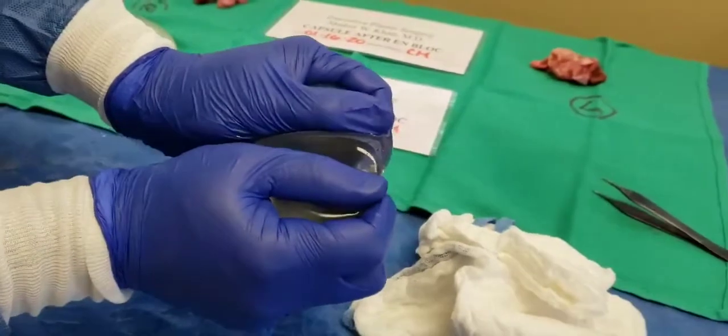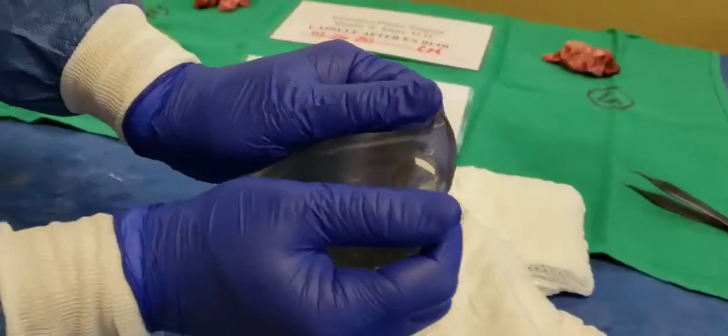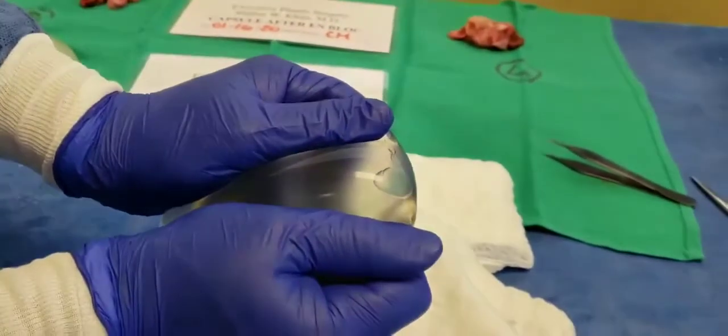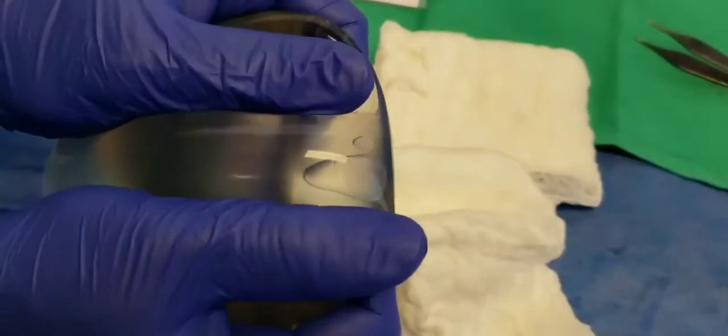And this was the part where they had more, as you can see, there is the small crack slash break in the implant right there.